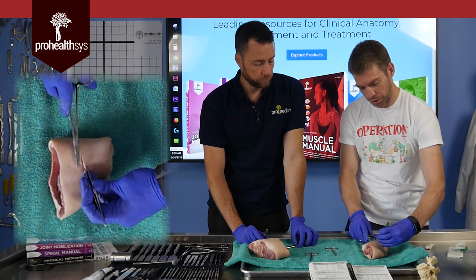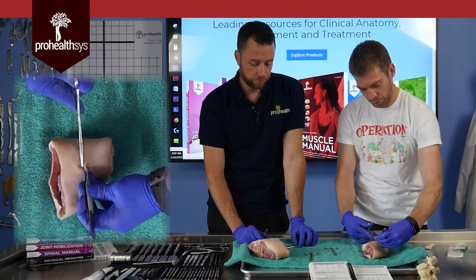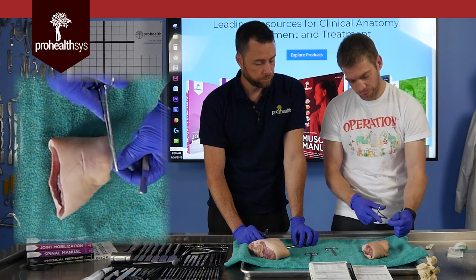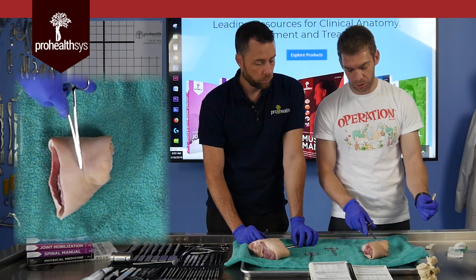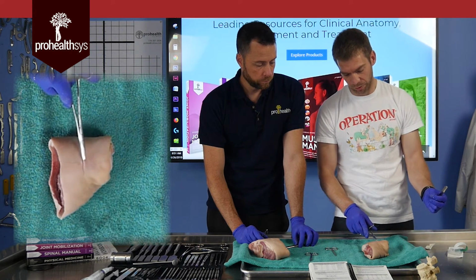So I'm going to reach underneath here, evert a little bit, come up hopefully with about the same, what they call a bite, the same distance from the edge of the laceration. Grabbing a little bit close to the needle there. Okay, what have we got? This is so-so. There's a little bit of an angle there, but it's not bad. If you didn't perpetuate that angle all the way along, that probably wouldn't scar. Mild angle there. I'm going to leave it in, okay?